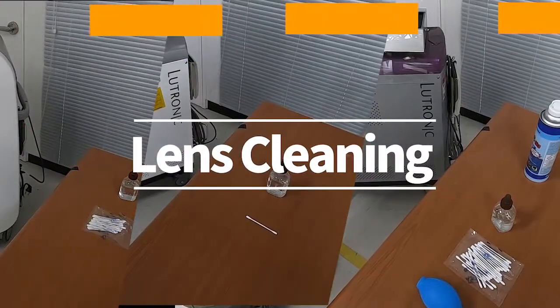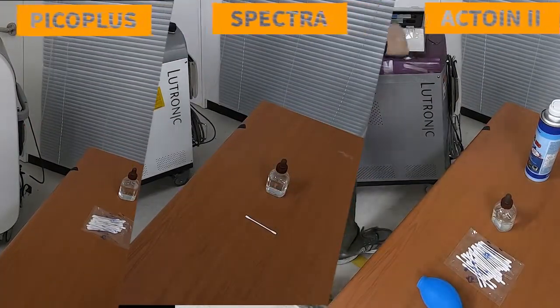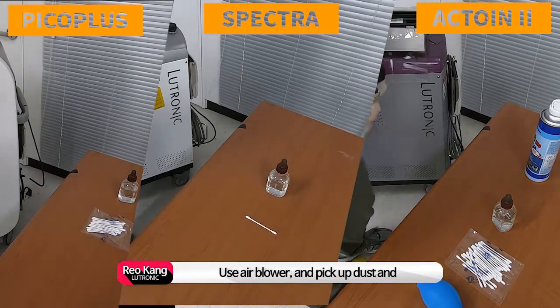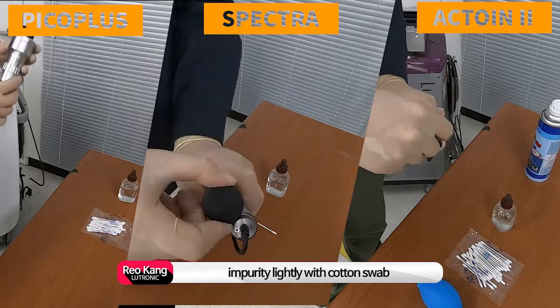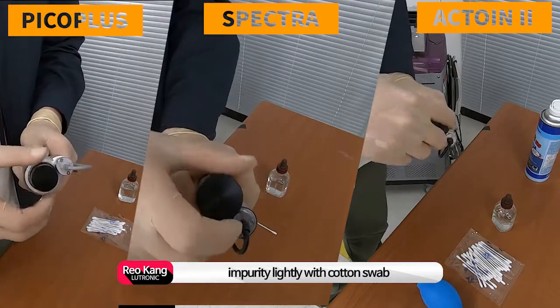Lens cleaning is done the same way. After air blowing, pick up dust and impurities lightly with a cotton swab.